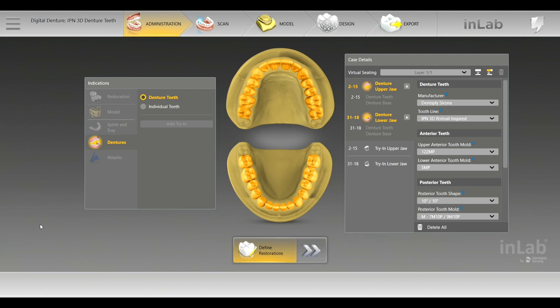The new Software 20 has the ability to use individual teeth — basically you can use a biogeneric, tooth molds, et cetera — and split the files. You'll be able to mill and/or print those. Today I'm going to be going over the denture teeth, the IPN3D portrait-inspired teeth, a very highly aesthetic tooth mold.